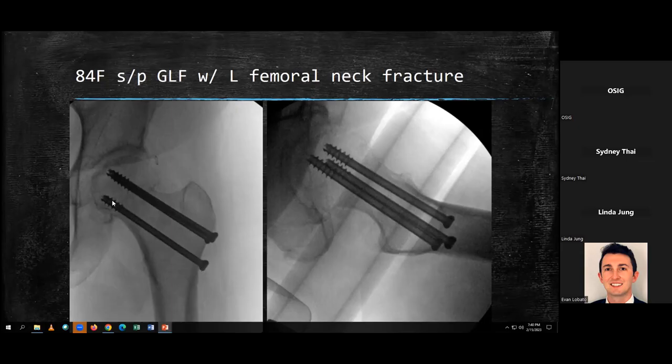So you pull the screw and the screw wants to move forward, but the head blocks it. And so the distal part of the fracture moves upwards, or you can think of it as pulling the femoral head. Either way, it allows for compression. So it resists that displacement. That's a way to think of it.